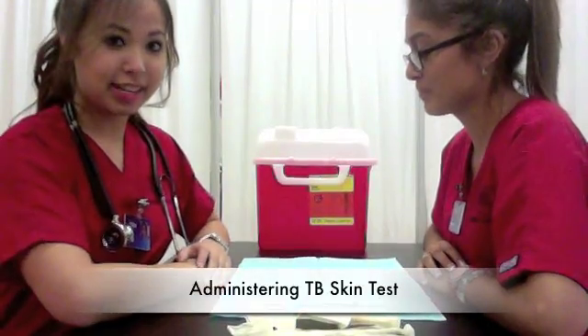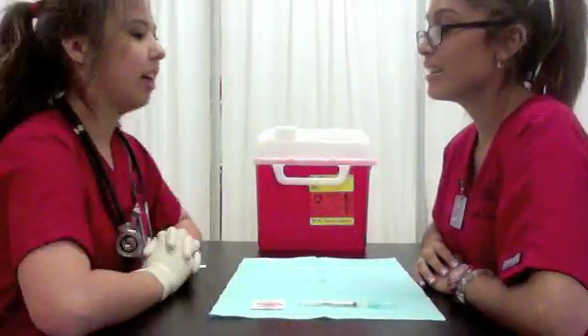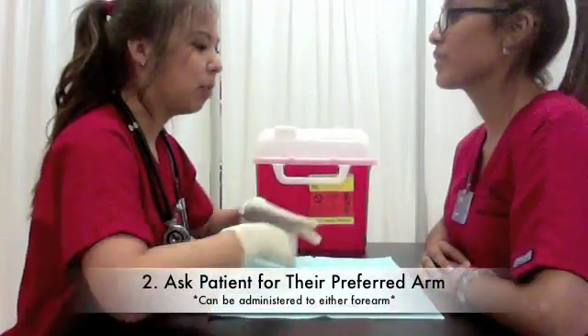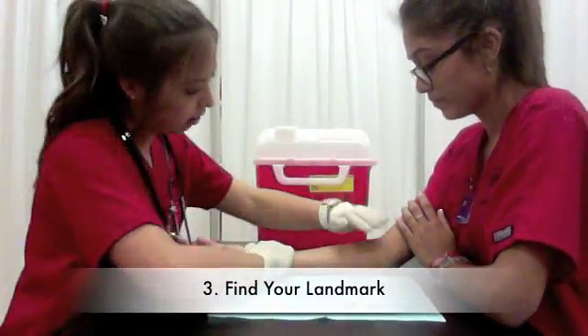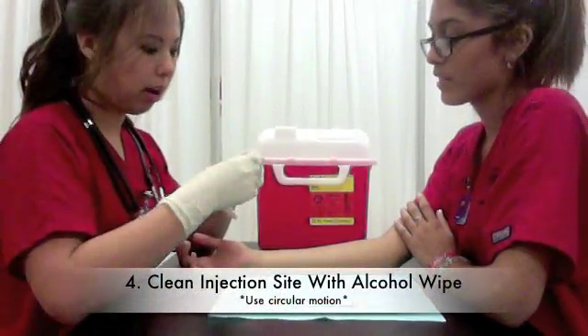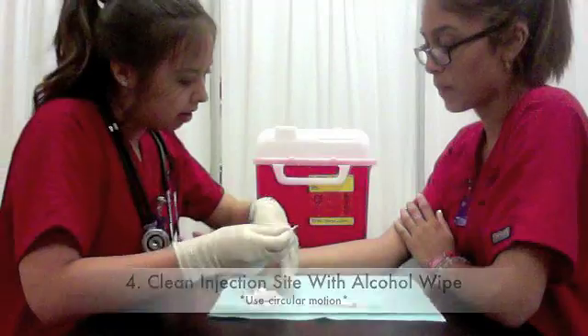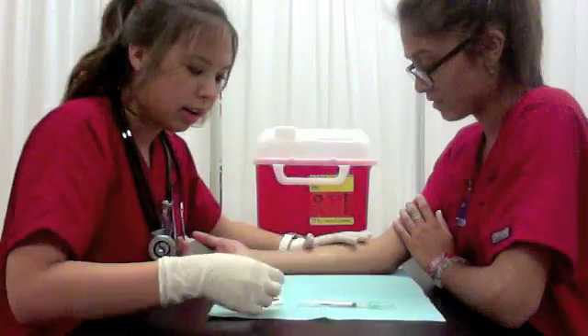Now we begin the intradermal injection. First, put on your gloves. Then you ask your patient which arm they prefer. Then you find your landmark, right there. Then you get your alcohol wipe and clean the area in a circular motion to avoid cross-contamination.